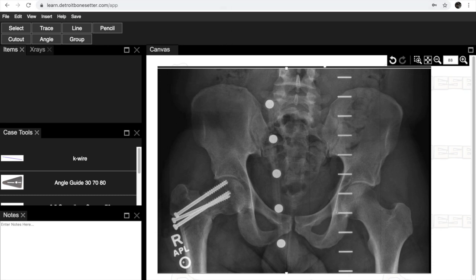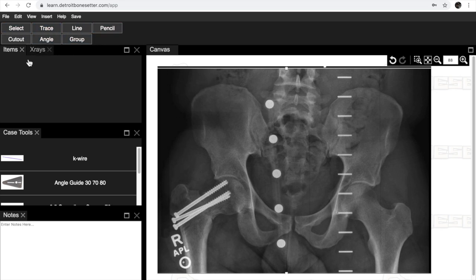We're going to use the Bone Setter app and give you a little primer on how this works. There's a couple parts of the app. There's some tools up here. This is where you find your items that you have.